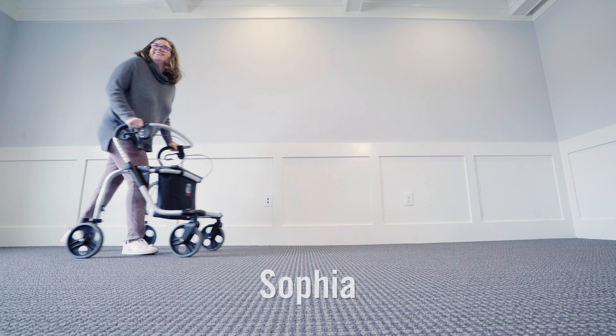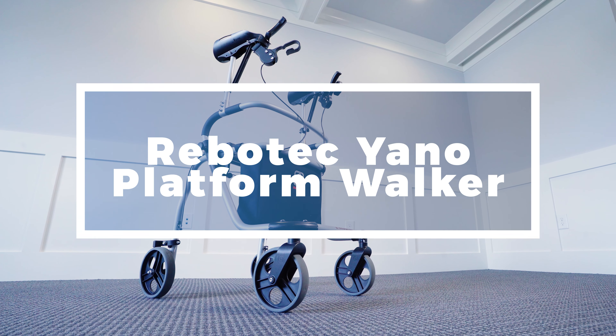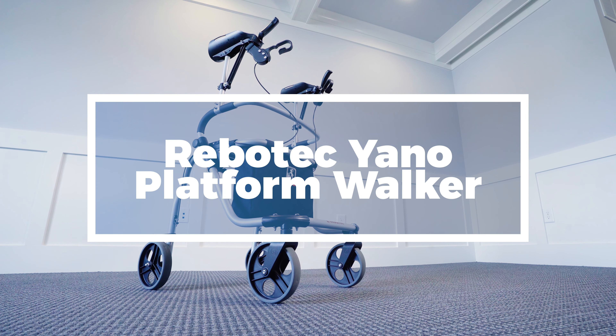Hi, my name is Megan Smith and I have a daughter who is 17 years old who has cerebral palsy. I'm also a physical therapist for the past 21 years. We've tried a lot of different types of walkers, and one of which we tried just this last week was the Yano by Rebotech platform wheeled walker.